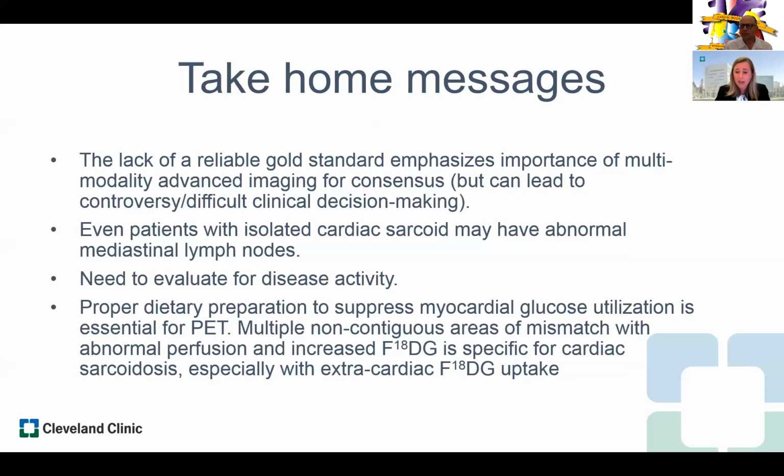If there's any abnormalities on the echo, including reduced cardiac strain, I would then suggest moving ahead with a cardiac MRI, doing not only the cine images, obviously, but the edema-weighted sequence and the delayed enhancement imaging, to give you more of an idea about underlying smaller granulomas that may not be impacting so much on gross LV function, but that if you were able to pick that up early, may be able to be treated and have an impact on the patient's overall morbidity long-term if you're able to institute therapy sooner.